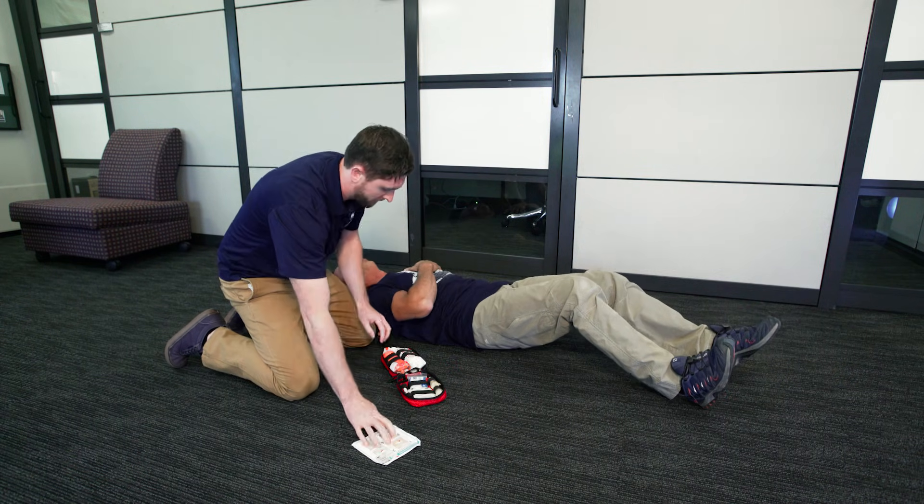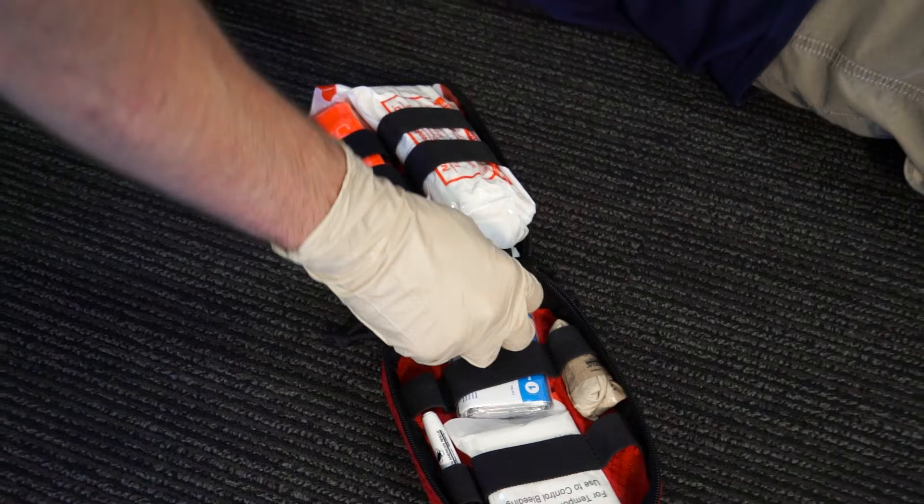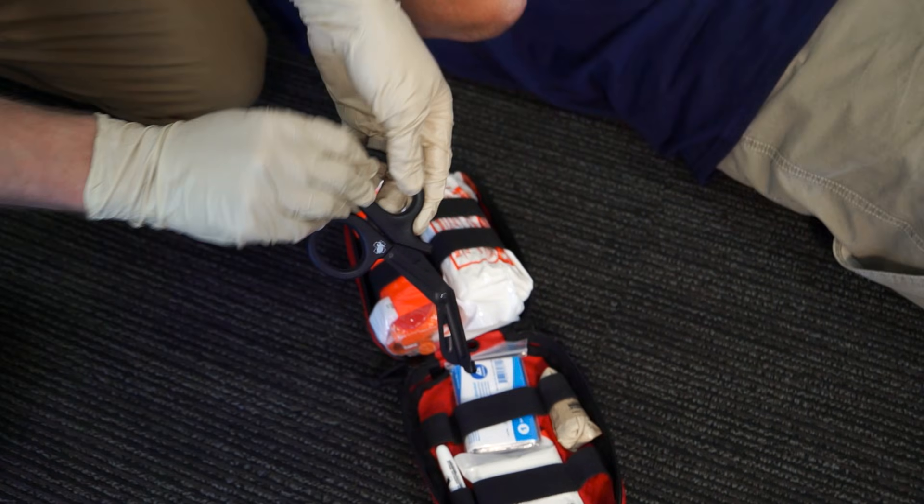Remove the instruction booklet and follow along as needed. Gloves should be worn during the application. Remove trauma shears from the kit.